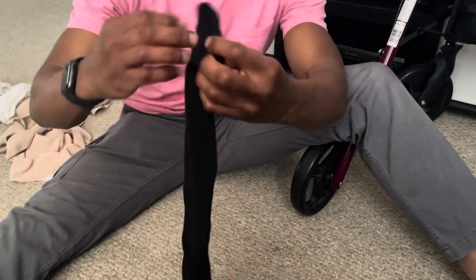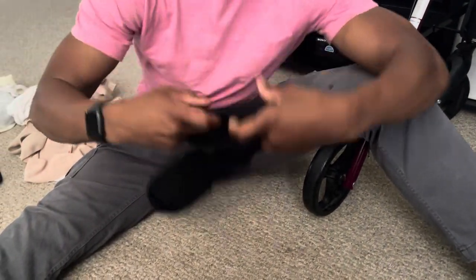Hey, my name is Jared. I'm an occupational therapist and a lymphedema therapist, and this is my review of the Circaid Juxtalite HD.